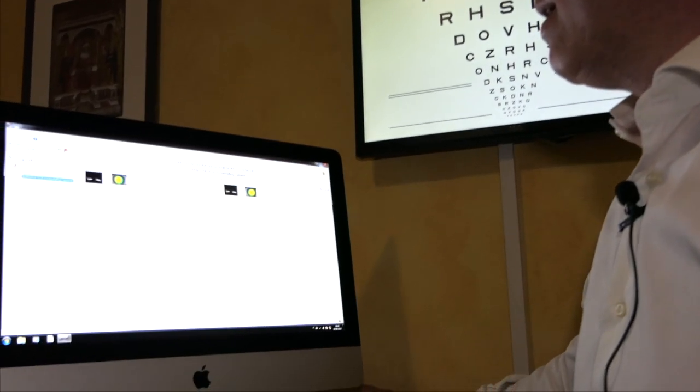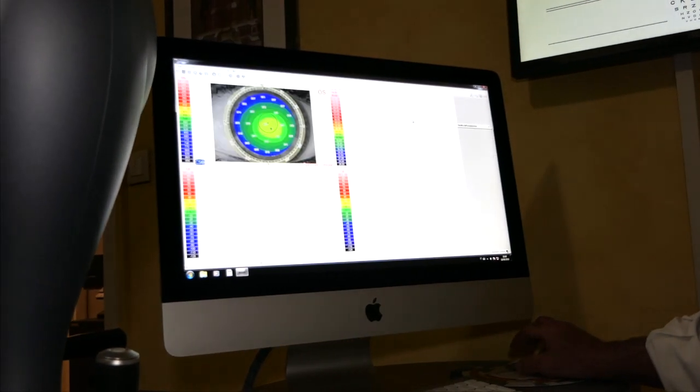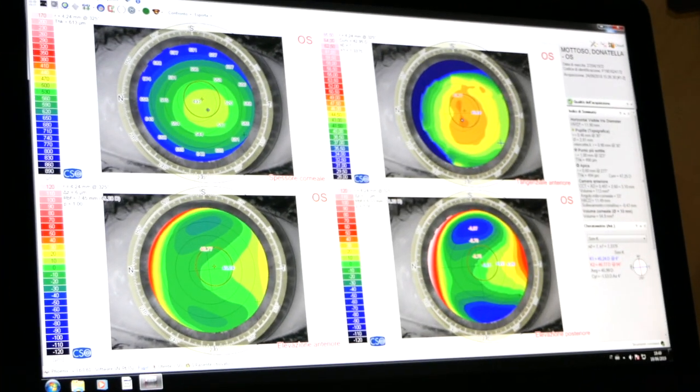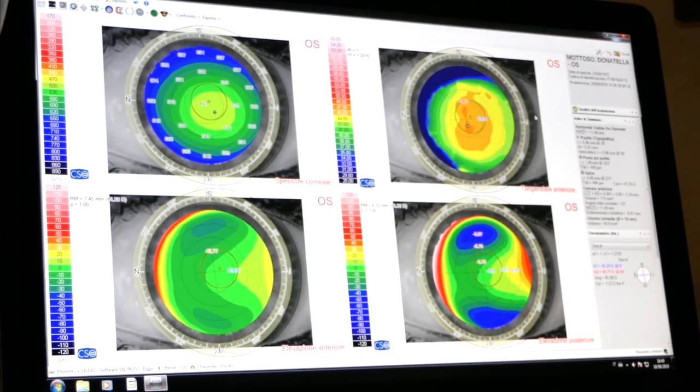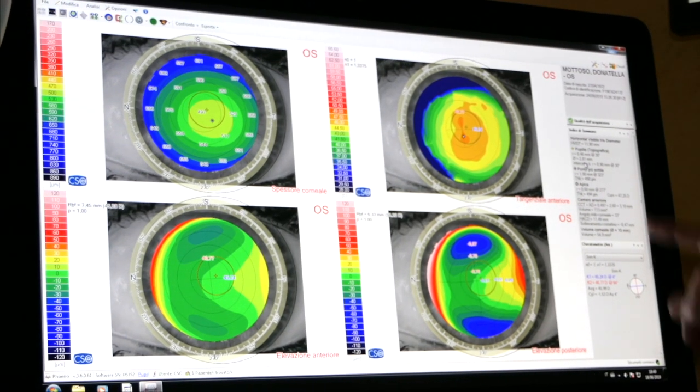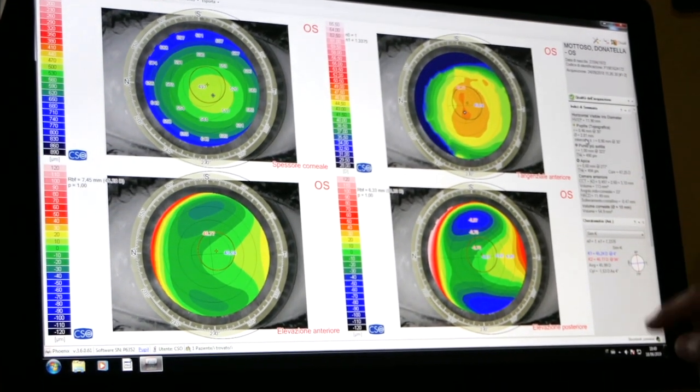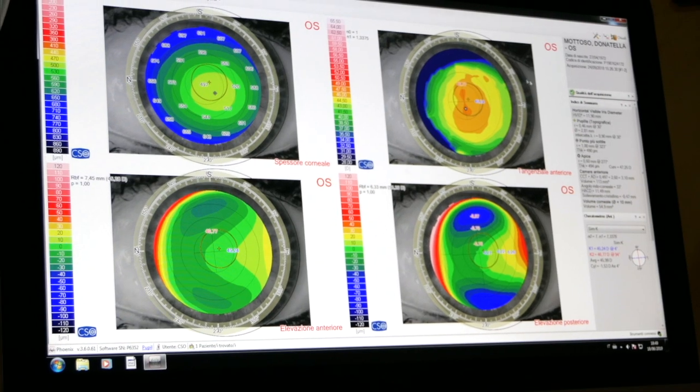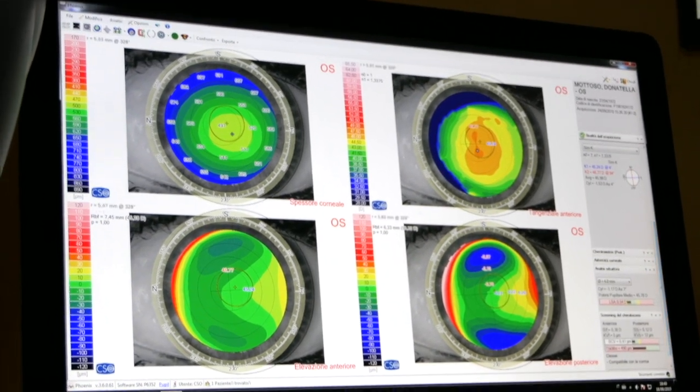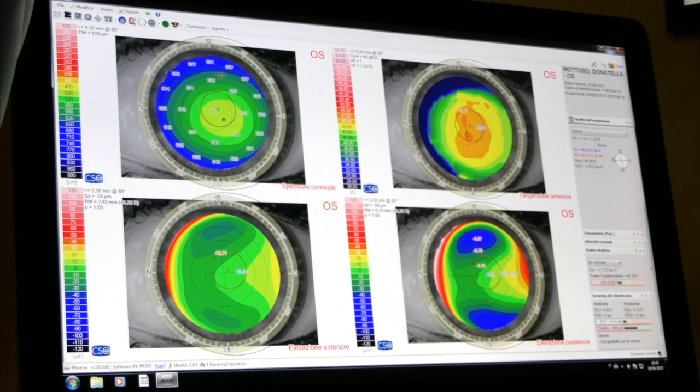A screen appears with a series of numerical values which the ophthalmologist must know how to read and interpret, and it is a real map of colors. This color map represents the surface of the cornea, and we can select a whole series of parameters.